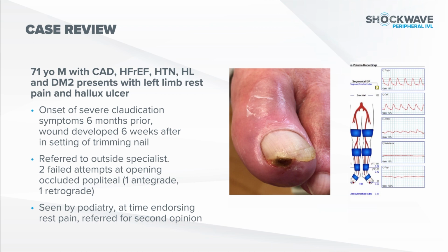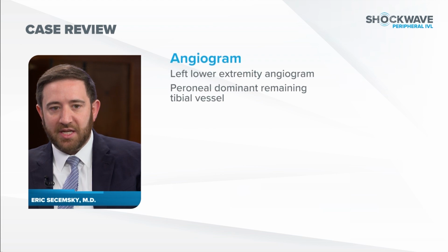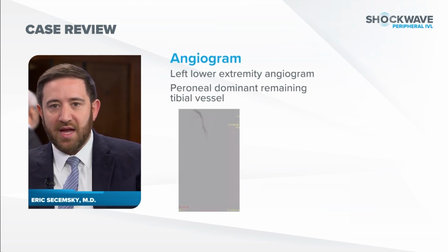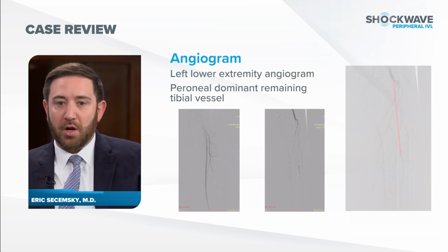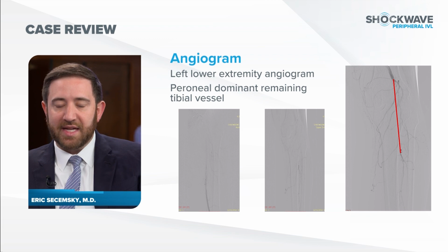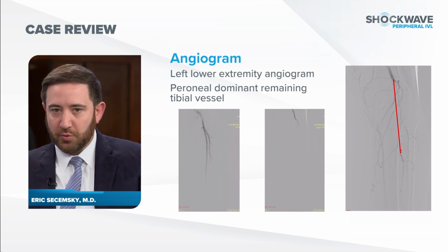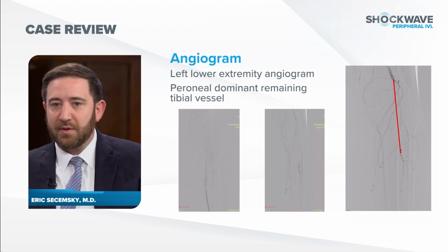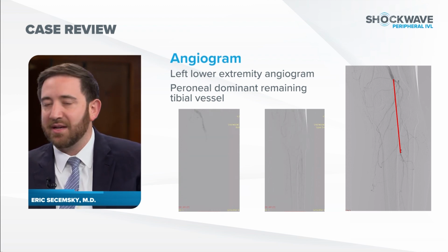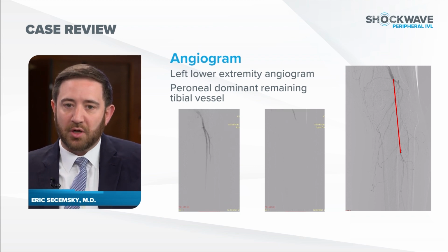So this is the angiogram. You can see that in a typical diabetic patient, he's got a fairly normal SFA, and then all hell breaks loose after that, and I'll let this keep playing. But you can see the pop occlusion here, really poor runoff. And this is a great case where DVA is something that we would consider. It was a little too proximal, really, for us to think about DVA here. Surgical bypass, we really had poor filling distally to understand what our distal bypass options were.